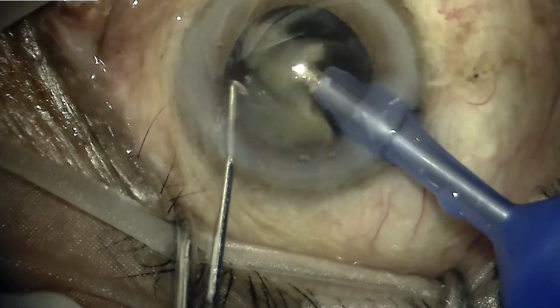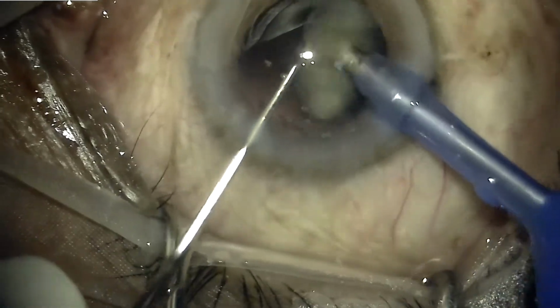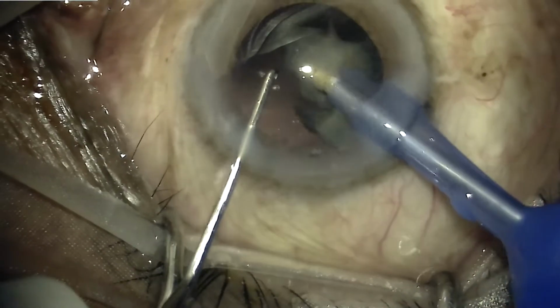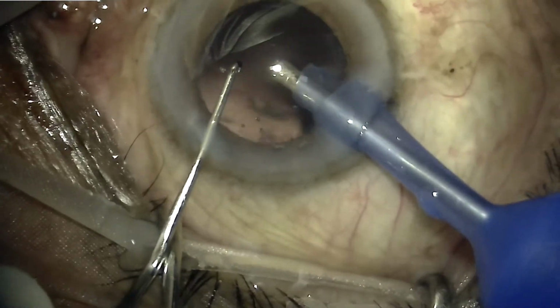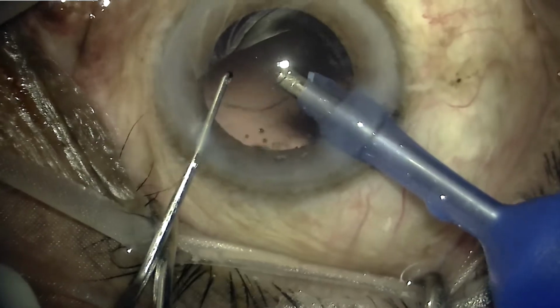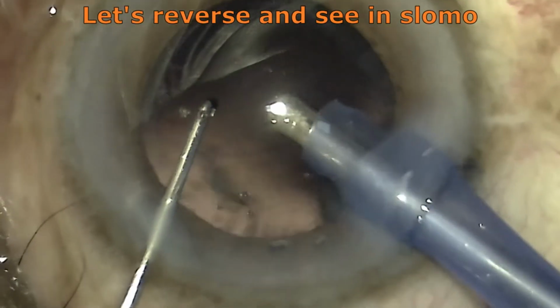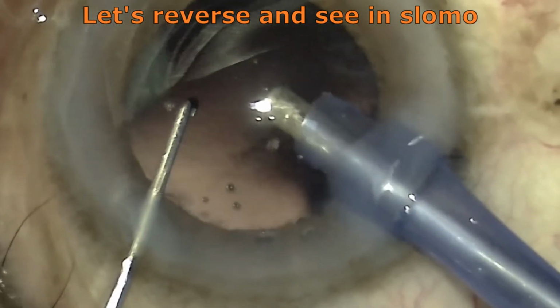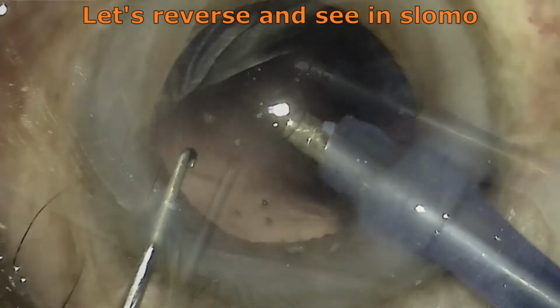Now, as we see, the last terminal part of the nucleus, when it is being consumed, there is significant surge which causes a PC tear. This is when it happens. Let's reverse it and see that again in slow motion. And we can see that this is the point where the PC tear occurs, and there is a small chunk of nucleus which goes inside.